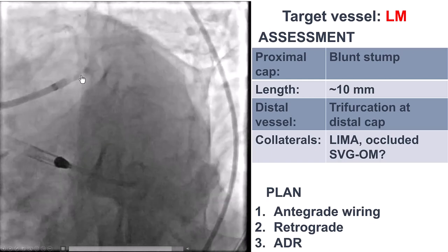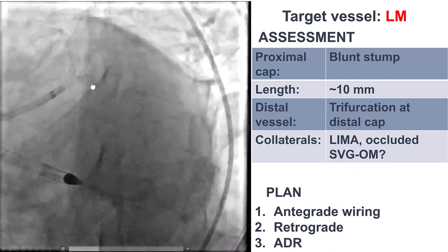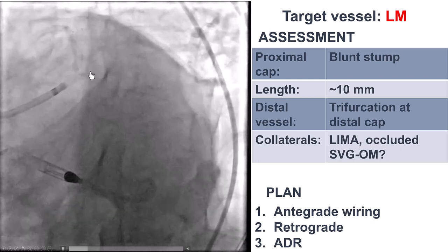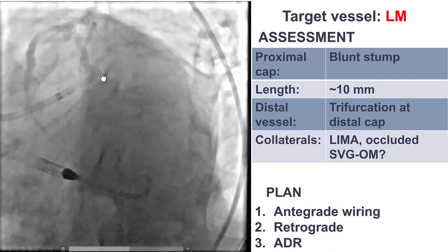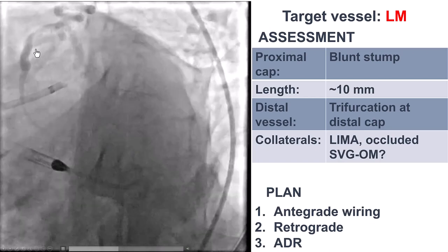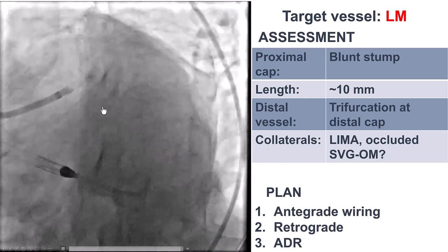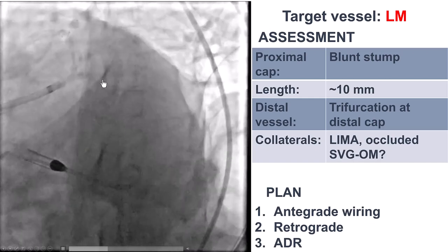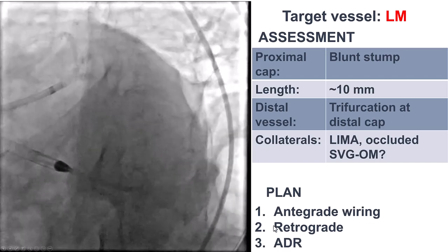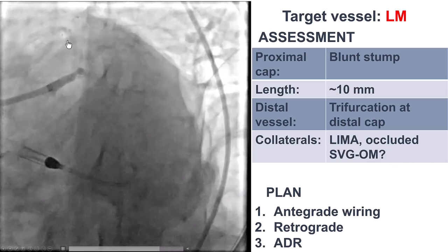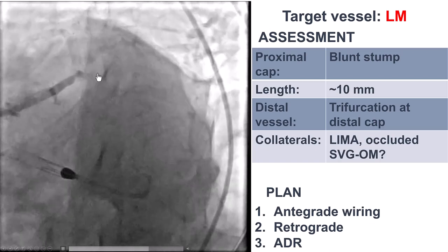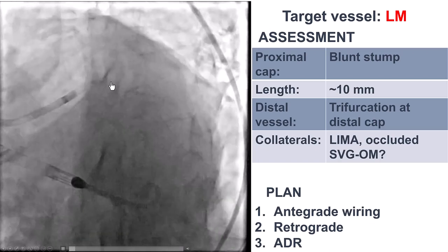There is a distal left main CTO with a blunt stump. The length of the occlusion is fairly short, and there is a trifurcation on the distal cap with the LAD, a large Ramus branch, and the circumflex. The LAD fills through the LIMA. The plan was to go antegrade. Retrograde via the LIMA was not appealing due to hemodynamic concerns; however, retrograde through the SVG was considered. If antegrade failed, the plan was to use antegrade subintimal re-entry into the proximal circumflex.